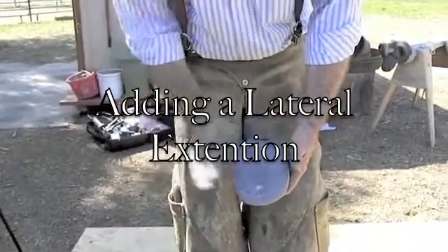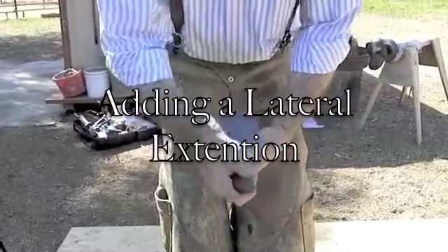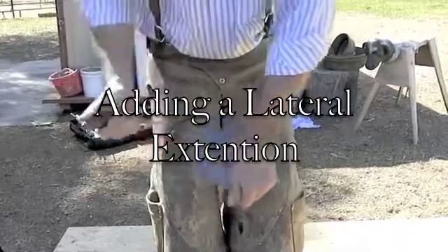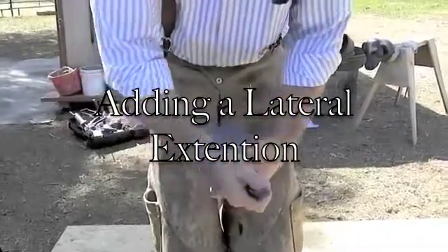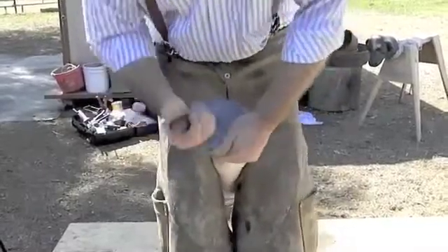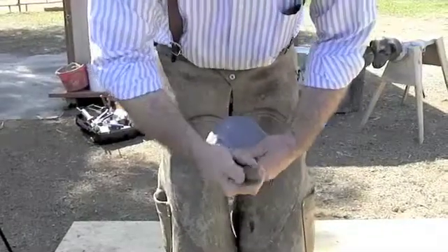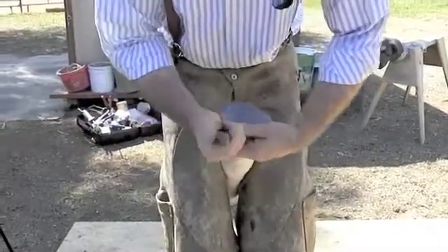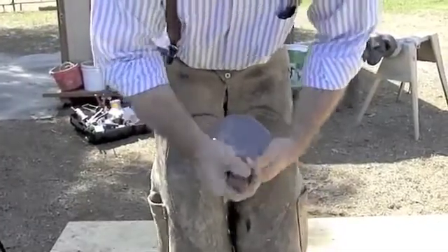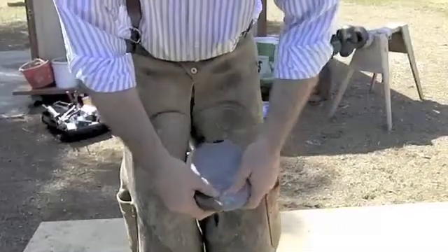Apply the cast to the foot and leave it on for about 20 seconds, take it off, re-wet it, and apply it again so the cast sticks to the foot. Once the cast is cured you can pick it up and trim off anything you don't like — any wrinkles or high spots — using a knife, rasp, or disc grinder to get a nice contour on the bottom of the foot so the horse has something nice to walk on. If you want to add a little concavity with the grinder, by all means go for it.